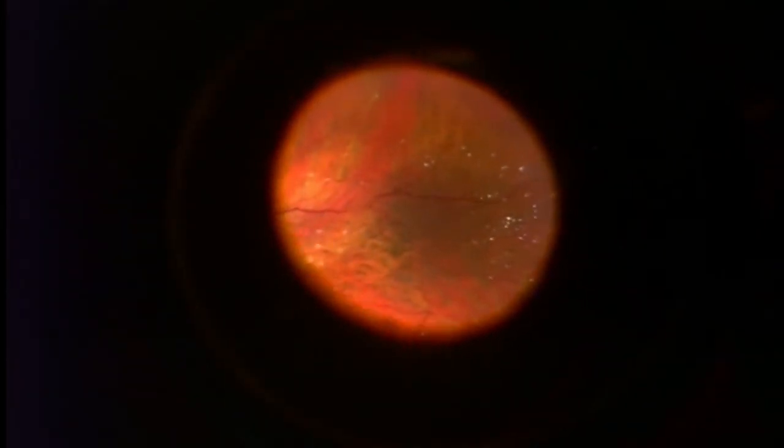Now as I go through and remove the vitreous, you can tell in this case that I'm removing the vitreous because the asteroid bodies are getting fewer and the vitreous cavity is getting clearer. At this point, I'm suspecting that there is no PVD or posterior vitreous detachment, because you can see some of the asteroid bodies kind of stuck or remaining close to the retina.